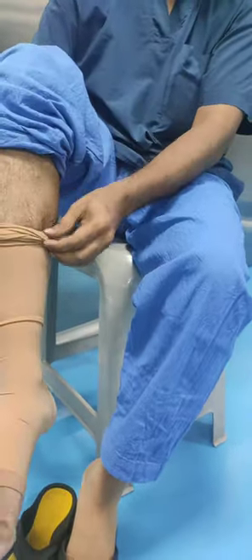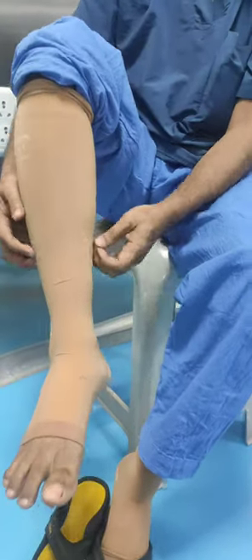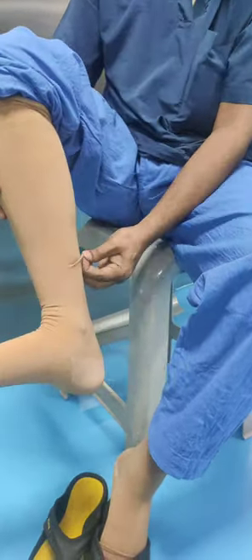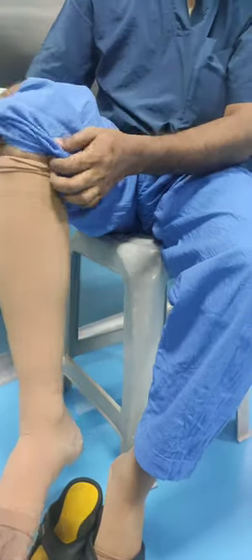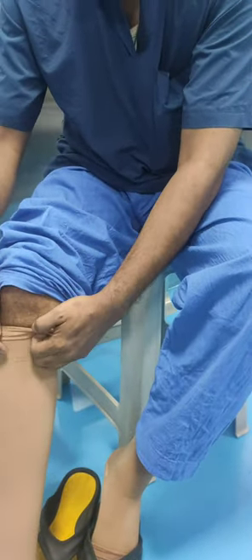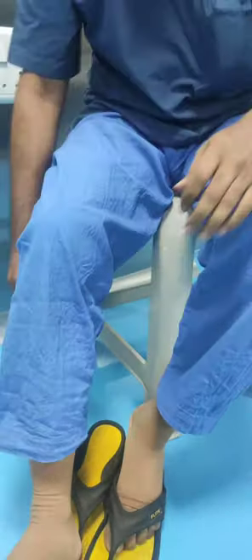The next step is to pull the knee end up to the knee and adjust the folding. The toe fold should be at the base of the toes, and the knee end fold should be proper.